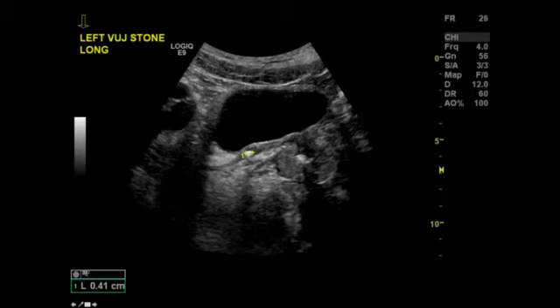Another stone here, and some twinkle on top of it. So here, a patient with a mild hydronephrosis, a distended proximal ureter, and then when you get down to the bottom end, here, a little stone with a little shadow behind it, and that dilated distal ureter as you're looking on the right. And then some twinkle, and you see that it's twinkling nicely for us under Doppler.